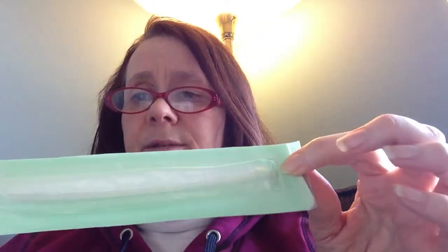Like I said, nothing bigger than a 10 French for me, sometimes an 8, but you can go all the way down to pediatric sizes, all the way to 5s, 6s, and 7s. So if you have urethra pain, small size matters in this case. And for most IC patients, the smaller the better.